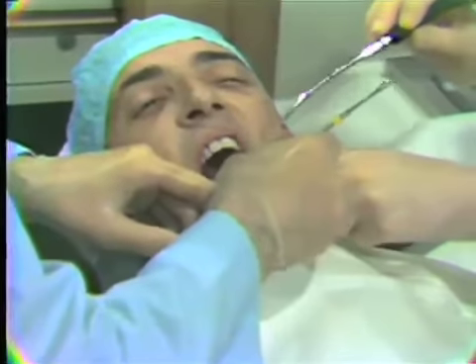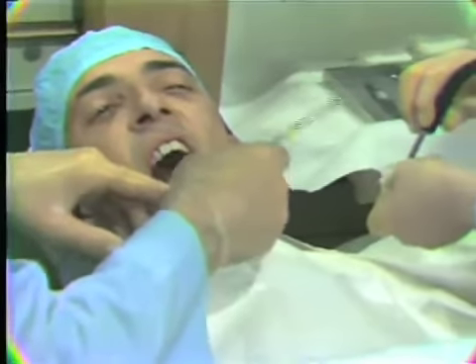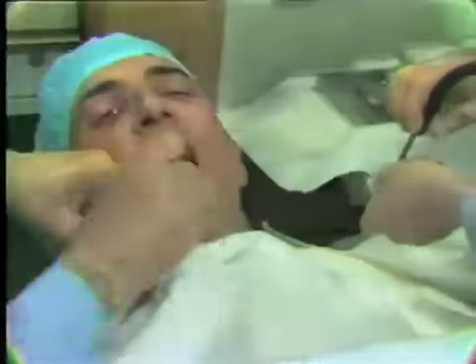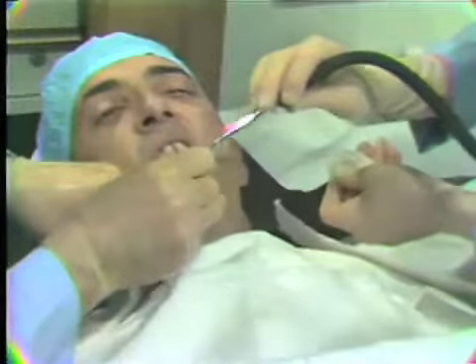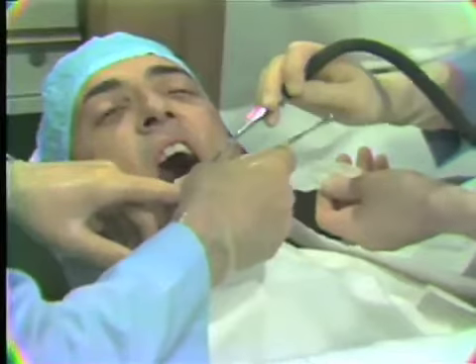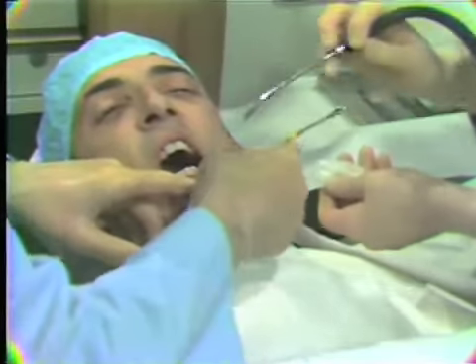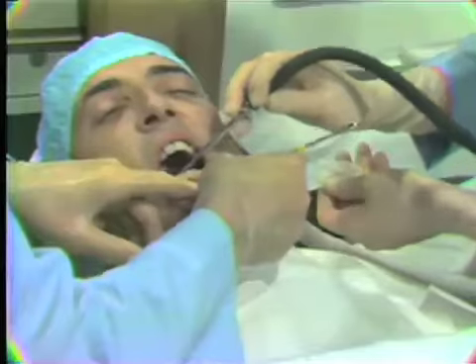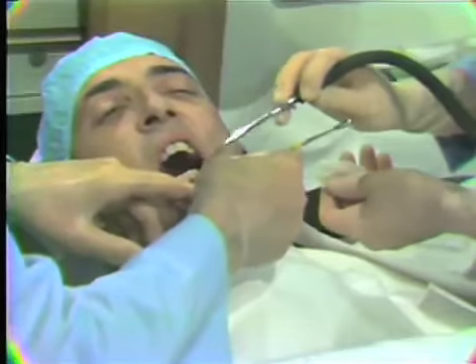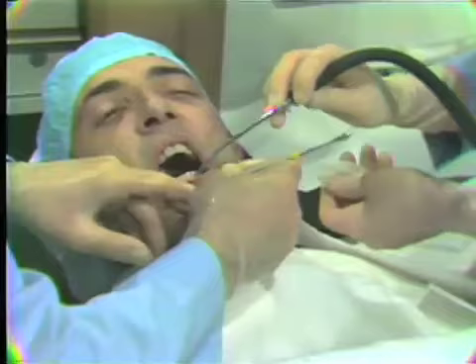The patient, many times having the accumulation of saliva in the posterior part of the mouth and the throat area, is somewhat bothered by the accumulation of this material, and periodic movement of the aspirator into those areas will help to relieve the discomfort or the uneasiness that the patient might feel with the accumulation of these products.